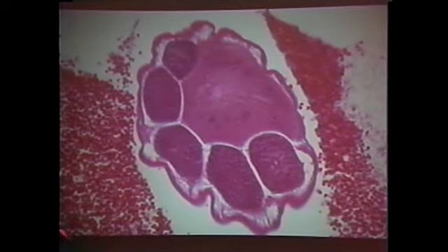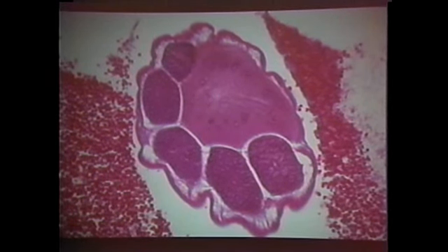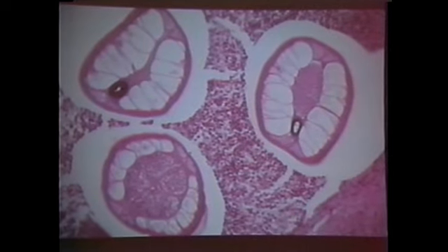Huh? Let's talk intestines. The muscles are one of the most important morphological characteristics we use, and the second is the intestine. Now, intestines are usually large or small. This is a large intestine, okay? This is a small. Sometimes worms slurp up juice in the tissues, and sometimes they get blood. Sometimes they get the iron from the breakdown of blood cells. Well, that's the tiny little bitty esophagus. You see that? So that's small, that's large.